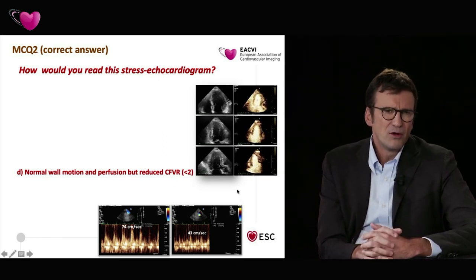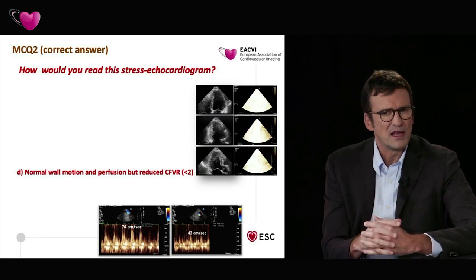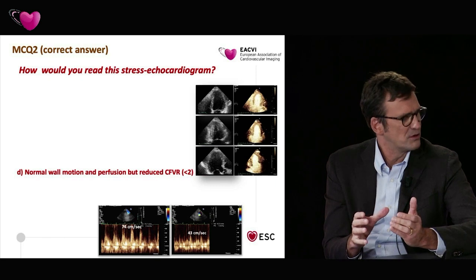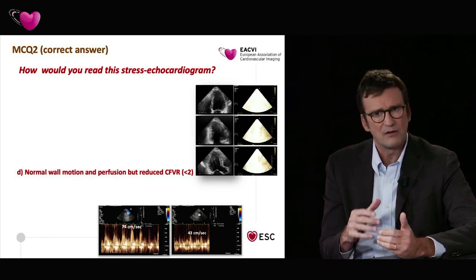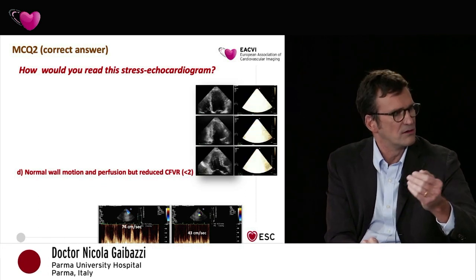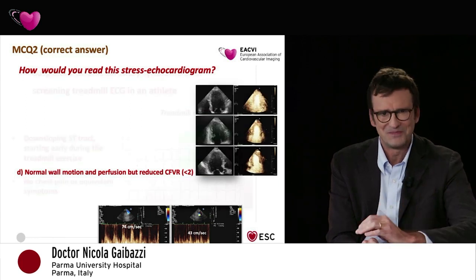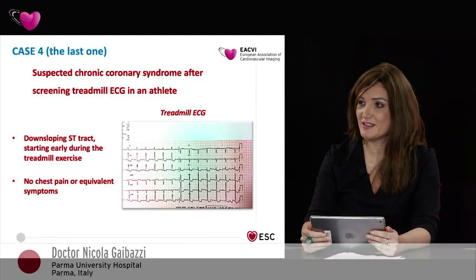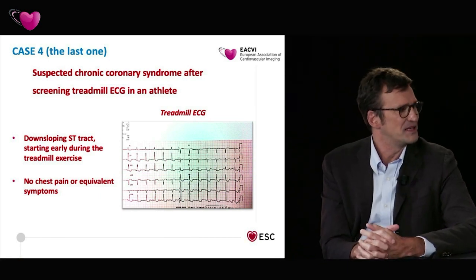But that also explains one of the problems of myocardial perfusion. That's why I'm always saying that contrast is more than perfusion, because perfusion is the top quality that you can reach after a learning curve, but contrast helps you a lot for wall motion also and for Doppler. So finally you will be also able to read perfusion. How long will it usually take? I don't know, but some dedicated time is needed.